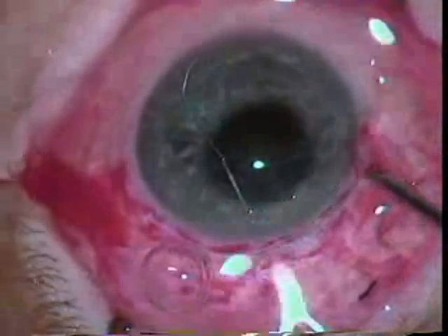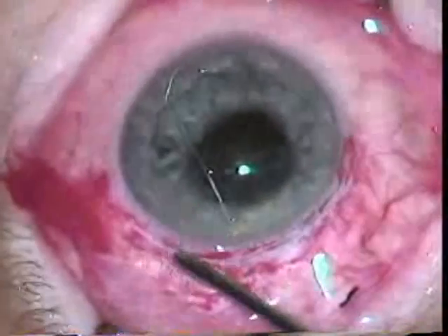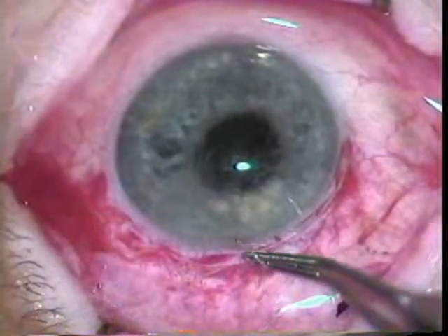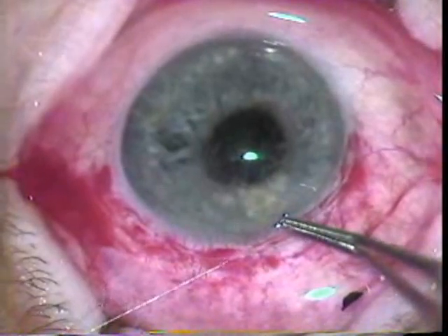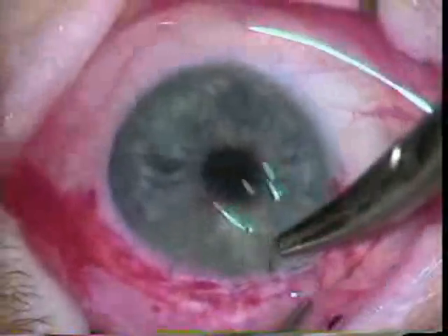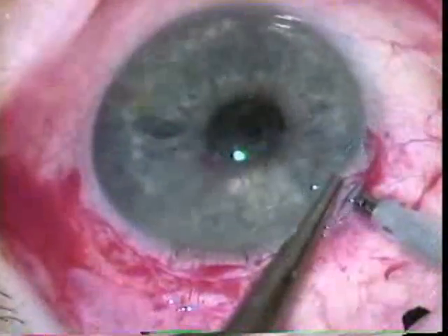The residual cortical material is removed after closing this one safety suture. A couple of additional 7-0 Vicryl sutures are placed to allow closure of the eye during the irrigation aspiration.